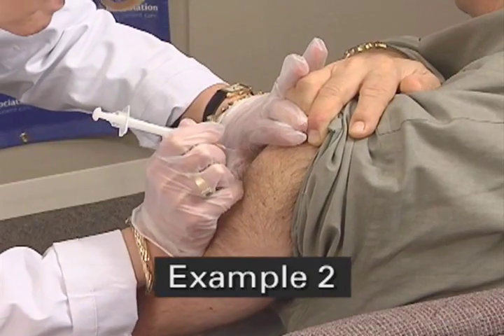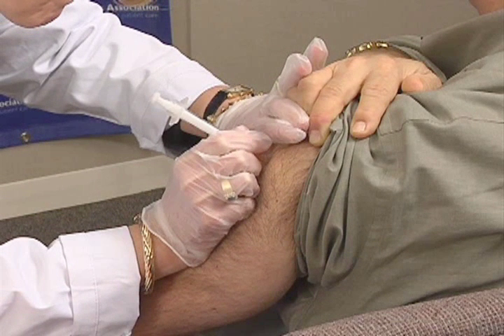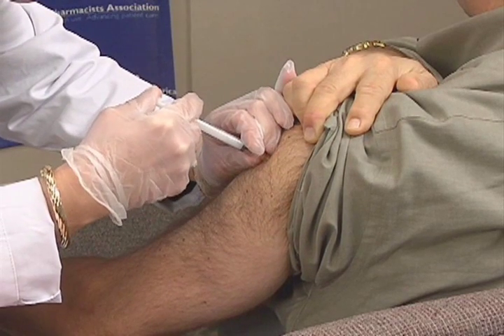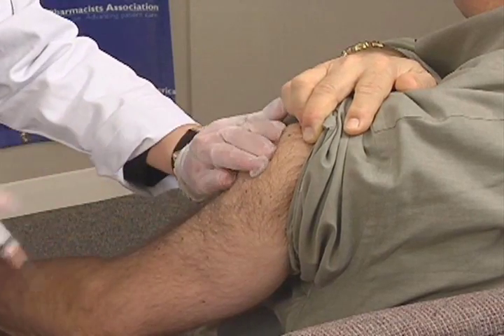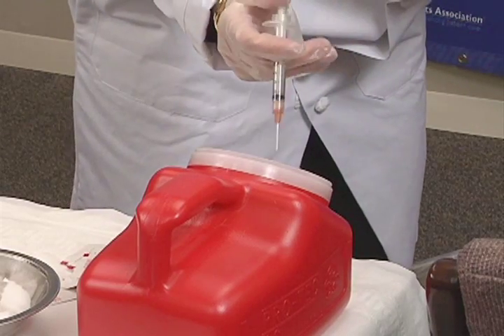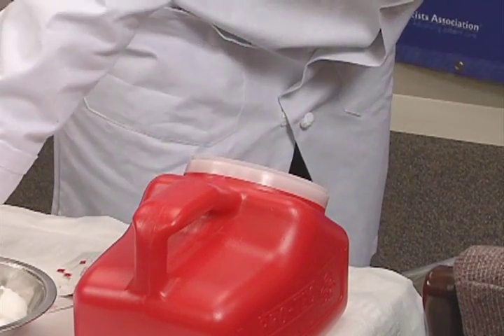In an alternative intramuscular injection technique, hold the syringe near the hub and insert the needle at a 90 degree angle all the way to the hub. Maintain contact with the patient at all times. While supporting the patient and the syringe, depress the plunger in a smooth and coordinated manner, then quickly withdraw the needle. Immediately activate the safety device and dispose of the syringe and needle in a sharps container.